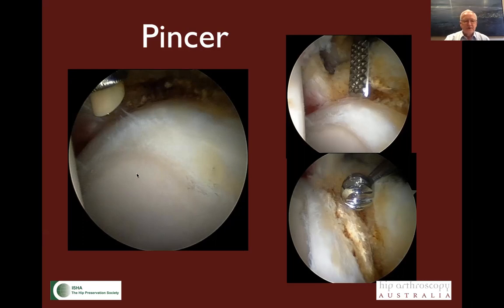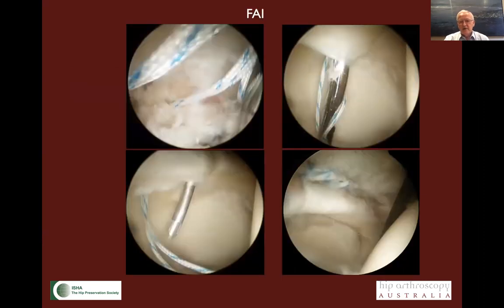If the junction between the articular cartilage and the labrum remains intact, then that can be left. But if they separate, leaving a labral tear, as seen here, then that labrum needs to be repaired with a series of anchors placed in the bone and sutures passed through the labrum, tied outside the labrum and replacing it in its proper position.